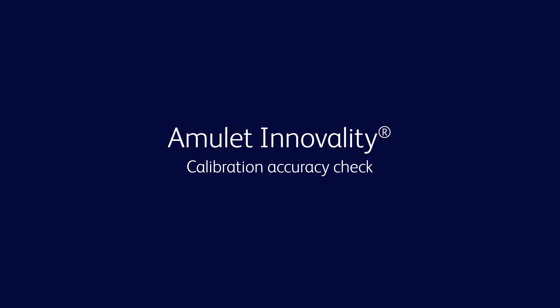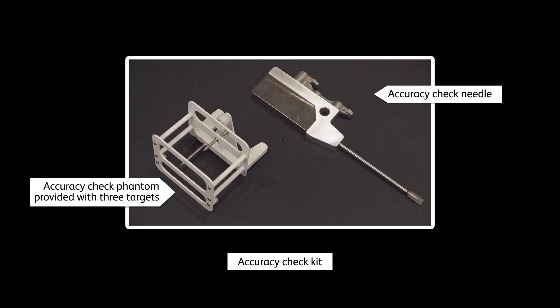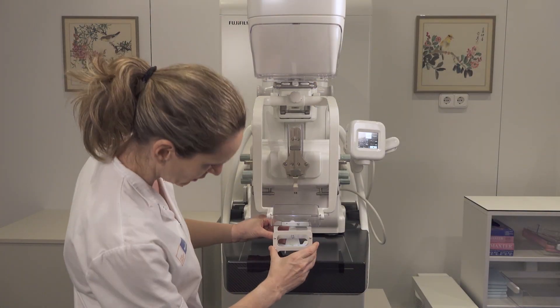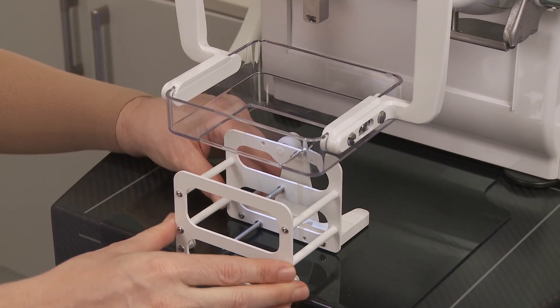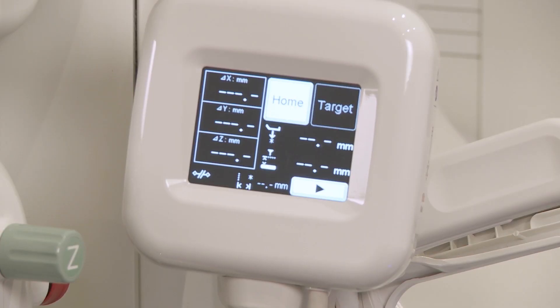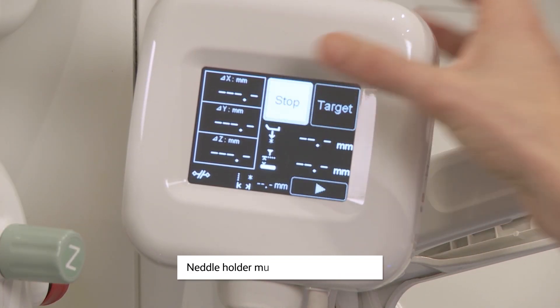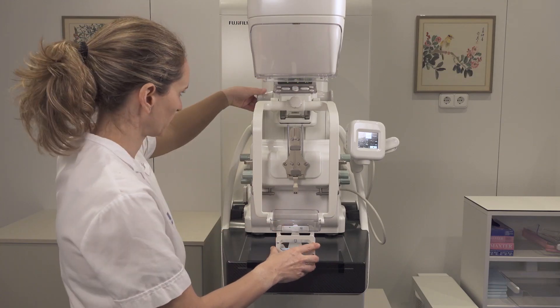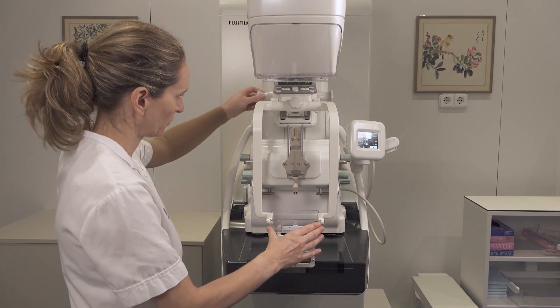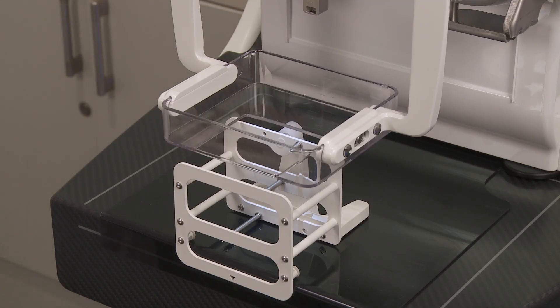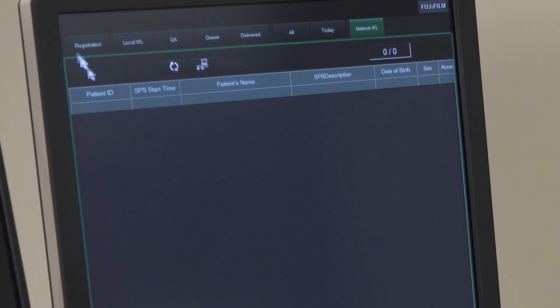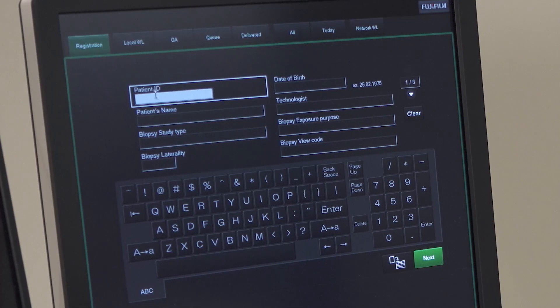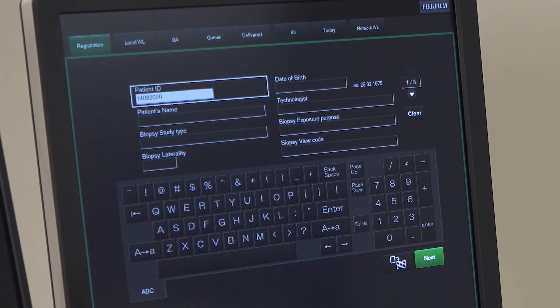Calibration accuracy check steps to follow: Place the accuracy check phantom over the breast support as shown and apply a light compression. Register the calibration check patient information as required and start a biopsy exam to run a calibration accuracy check.